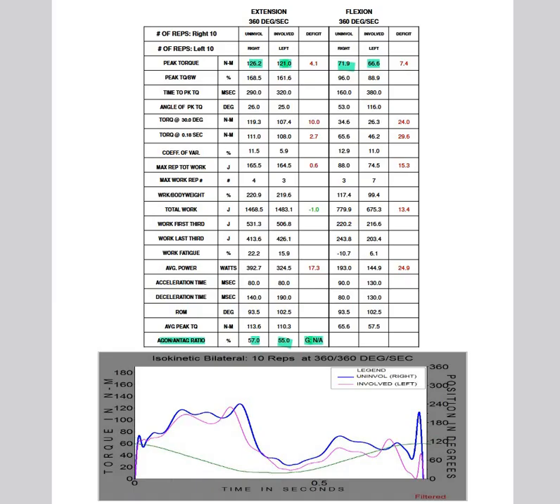So what I'm saying is, don't look at this and think, oh, this is just meaningless, it's rubbish. No, you can still infer information from it, and you should, but at the same time be aware and perhaps even mention that in future testing you would want to consider an eccentric concentric test or a mixed HQ ratio to improve the accuracy, predictability and reliability of this test.